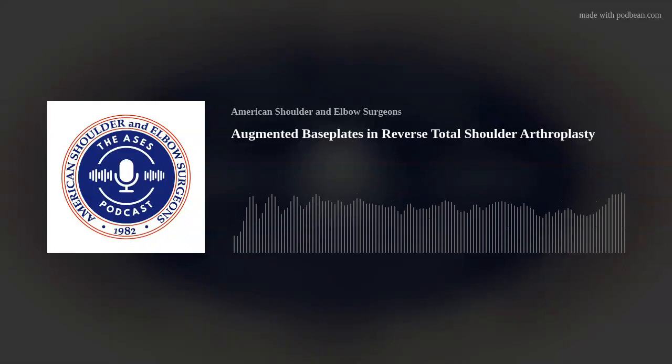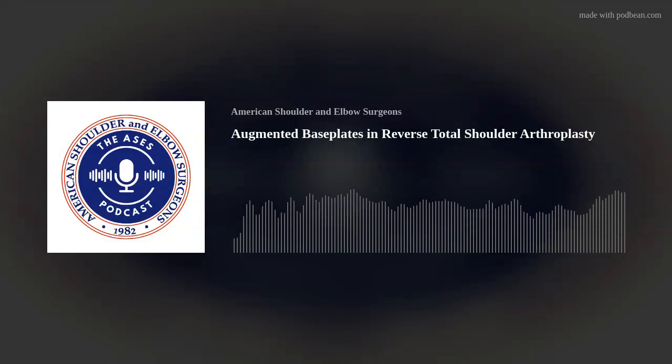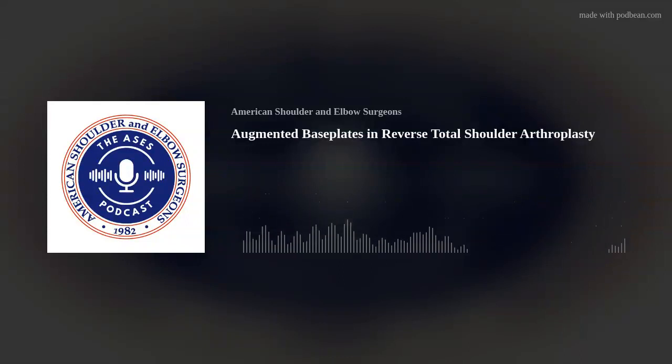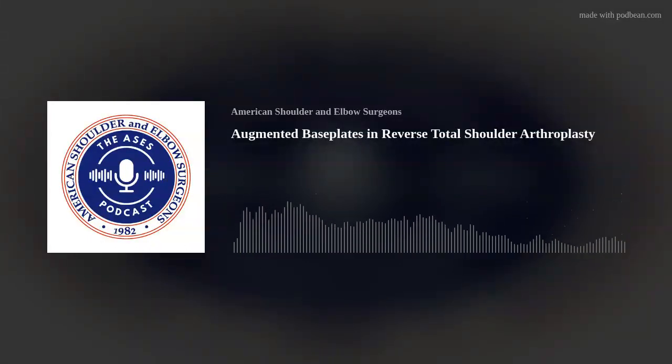My main goal is to try and get fixation. If it's really eroded and it's a small area, I'll use a PSI to try and find that. Some of these really medialized glenoids actually have a lot of bone, and I'll just find the bone and determine tension on the humeral side. And I do differ by gender, or as you have taught me, Peter, height of the patient. So a little bit different than some people who really want to sort of restore joint line.